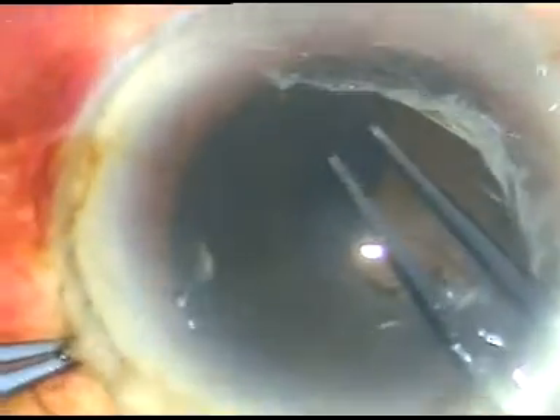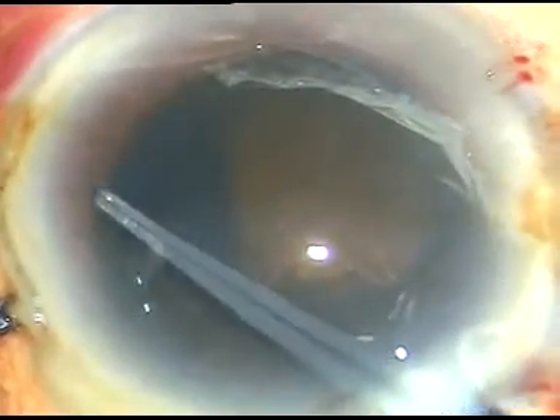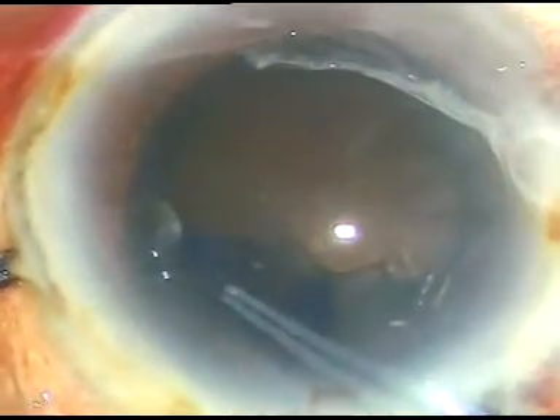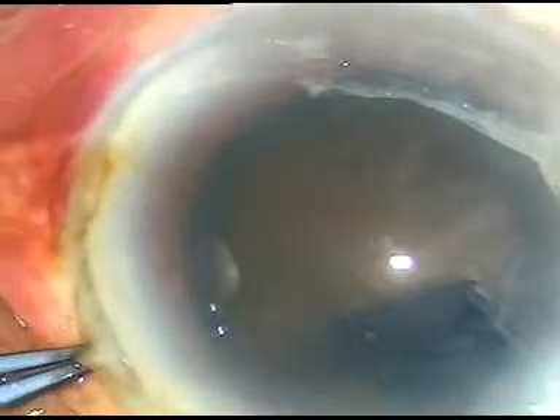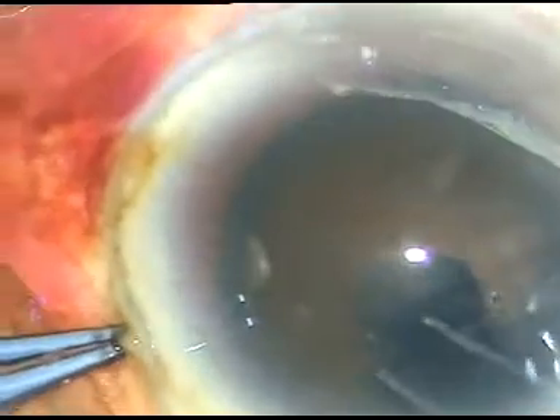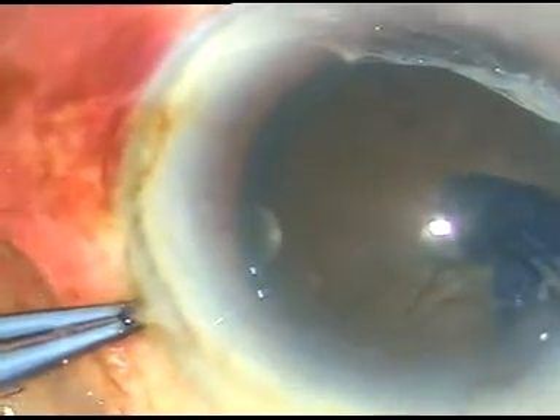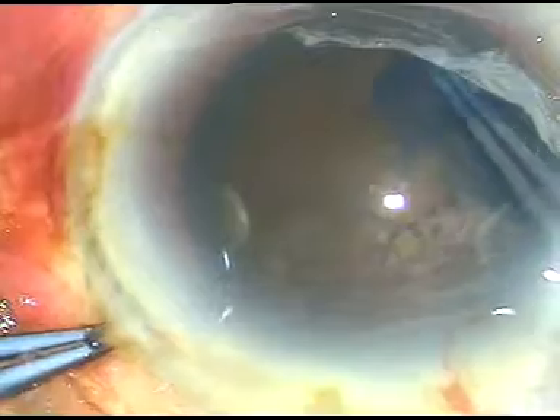I have started the capsulorhexis and I am making it as large as possible. I am almost through. That has been a very satisfactory capsulorhexis.